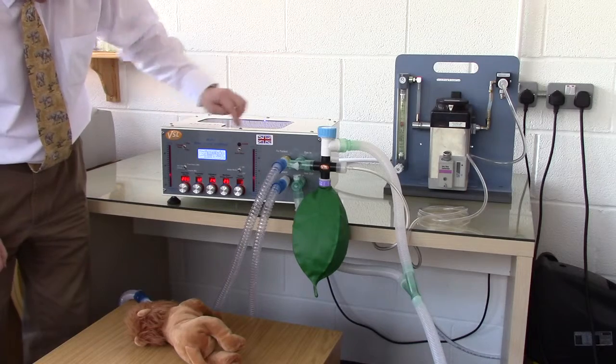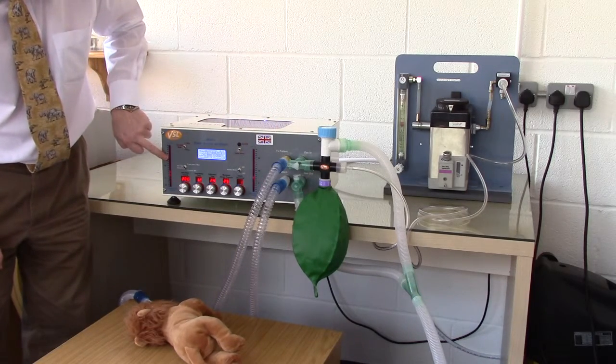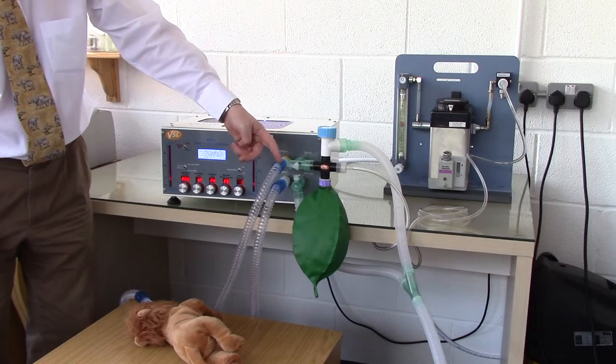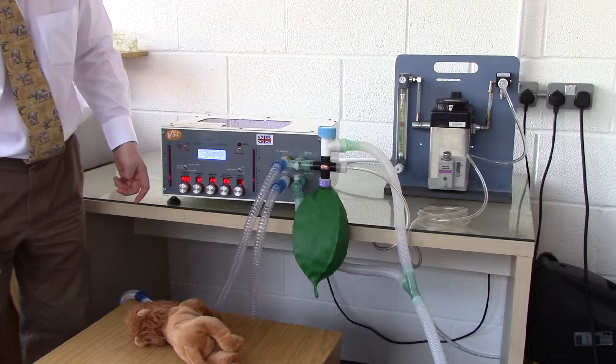As it's running, you can see the airway pressure on the display. Notice how the bag fills and empties as the animal breathes in and out.